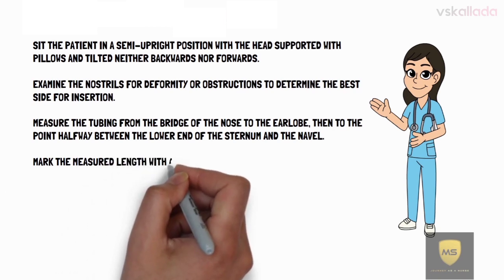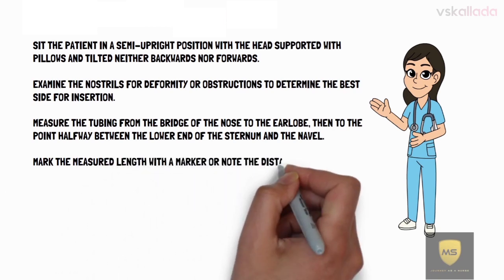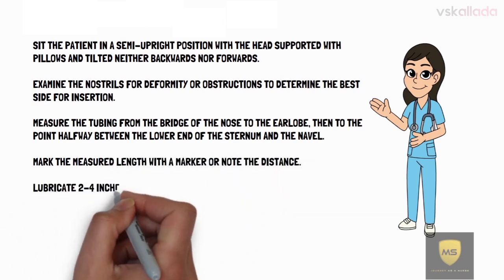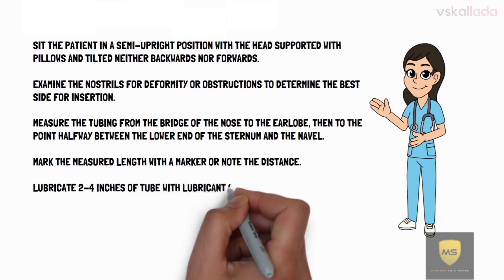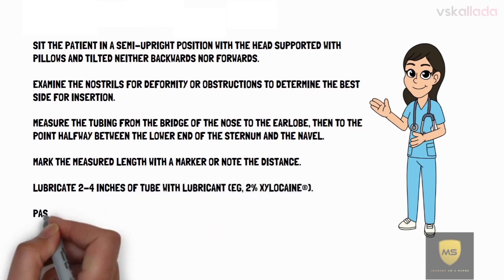Mark the measured length with a marker or note the distance. Lubricate 2 to 4 inches of the tube with lubricant.